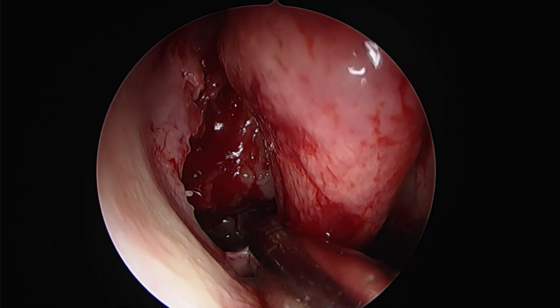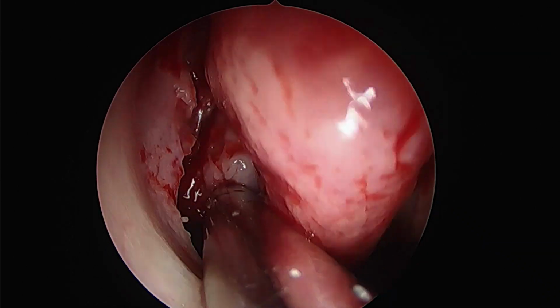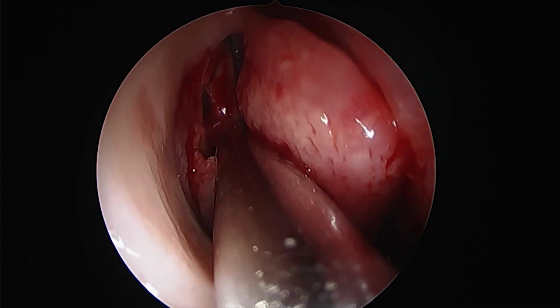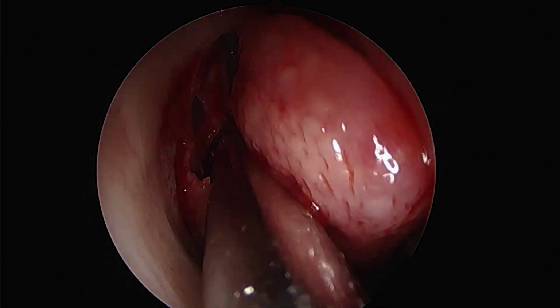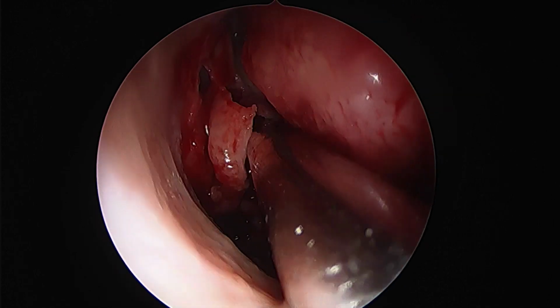This is using a microdebrider to create a reasonable amount of antrostomy, not too big. This is not a diseased sinus, so we just need to make wide openings of all sinuses. That is all, not to make them ultra wide. That is not the purpose.